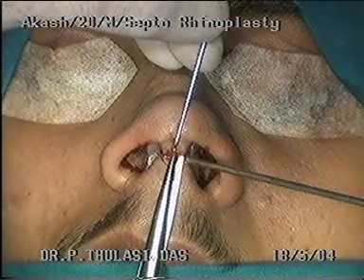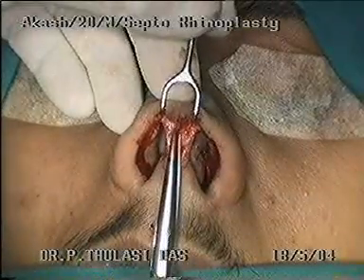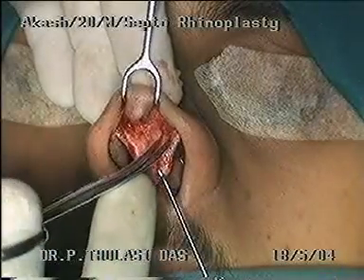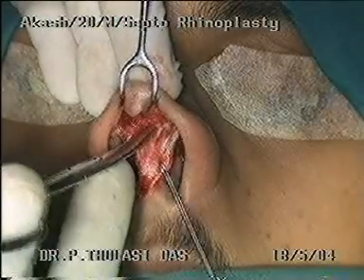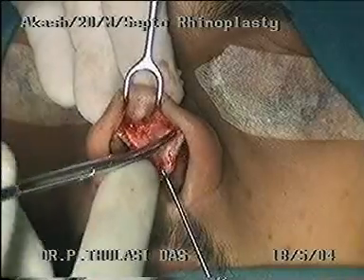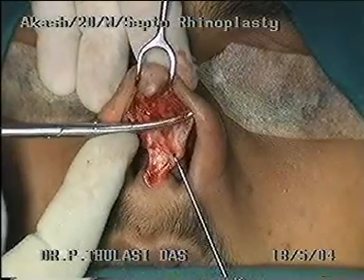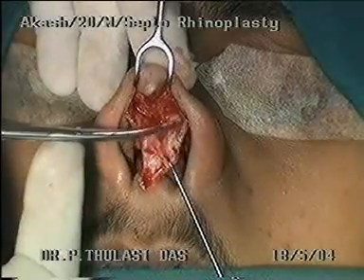The columella skin is dissected off with a combination of sharp and blunt dissection. Care should be taken to keep the lower lateral cartilages intact. The domes and lateral crura of the lower lateral cartilages are exposed as the dissection proceeds. Adequate retraction is important to reach the correct plane of dissection.